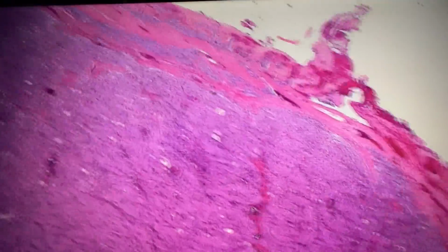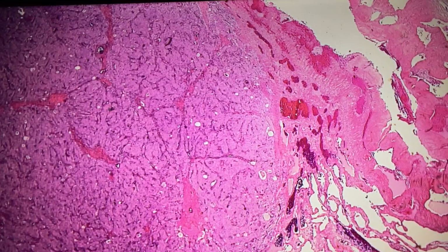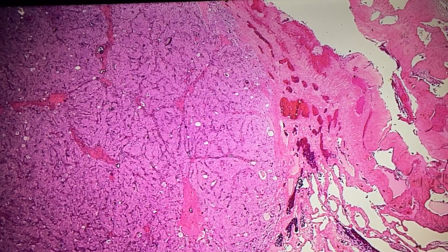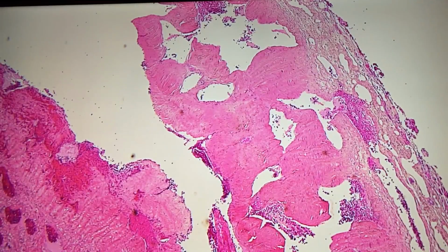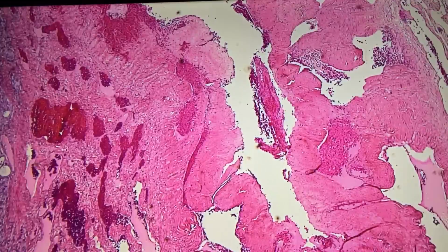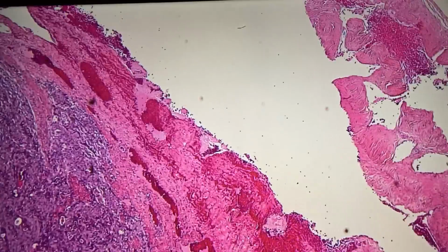Sure. Okay, so I'll just show you a very low mag scan around. This is a good field to show, right? This thing. Is it lung? It looks like lung, right? No, it's no pleura and no lung. Lung-like. But that's a good thing to talk about here because for you guys, it's good to recognize what this might be if somebody says this is from the brain, and you see that tissue.